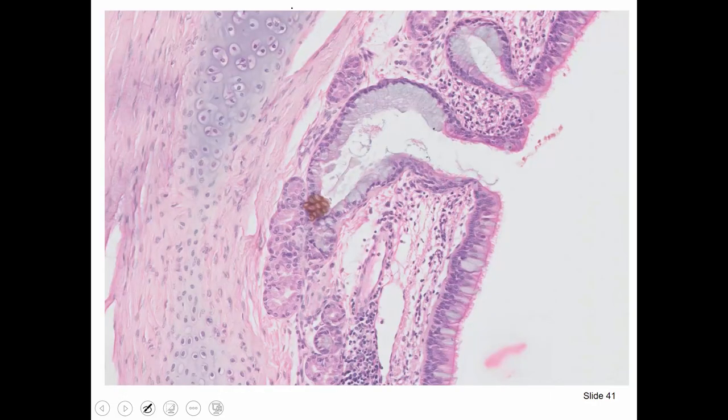Here is a nice area, so you'll feel comfortable. This is the lumen. I can tell you right off that this is cartilage, so I know I'm in the respiratory system, so I'm taking air in. The epithelium, okay? If I was to look at this and I ask the question, so here, take the pointer. Point to the apical surface, okay, if this is the lumen, where's the apical surface of the epithelial cell? Right there, apical surface, exactly right. Where's the basal surface? Perfect, okay? So that's the key, apical, basal.